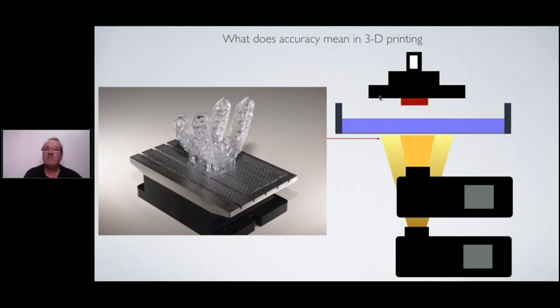That's why you see some companies with only very small build areas, because the projector distance is very close to the vat, to the liquid, and so they can print at 50 microns, but it's not really usable in the field because you can only print a small model. So we think 100 microns, and we can utilize nearly the full build surface, and we have not seen any difference. So that's why we print with 100 microns or something like 70 microns.